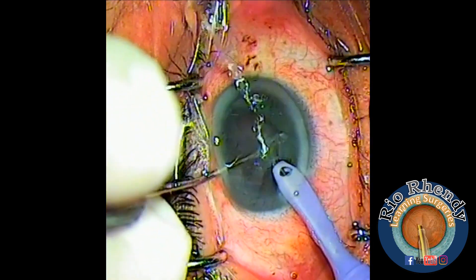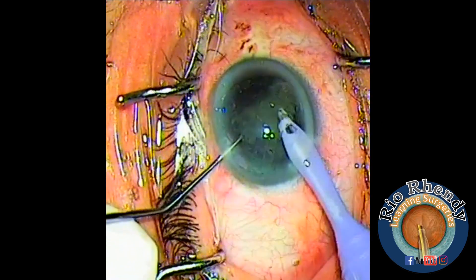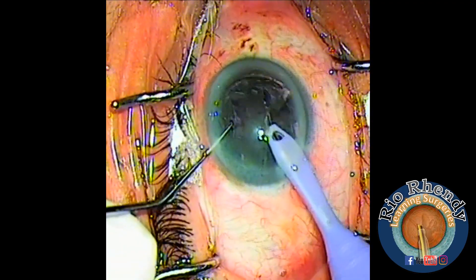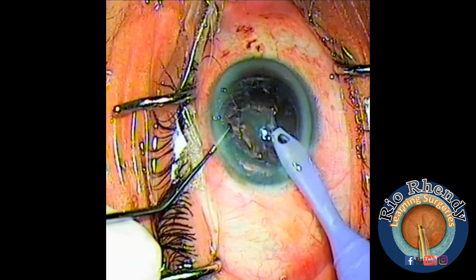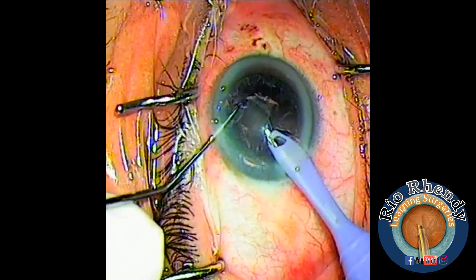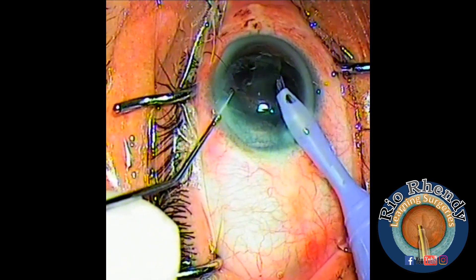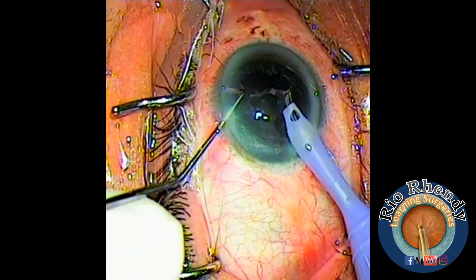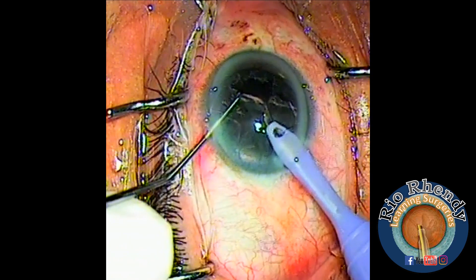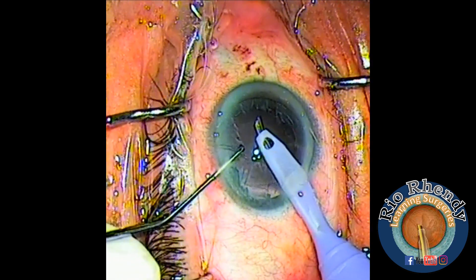One hemisphere is done; continuing with the other hemisphere. Sometimes you need to move the tip so irrigation and aspiration can be better and followability can increase. Sometimes it gets stuck with some lens material. Now we need to remove the cortex.